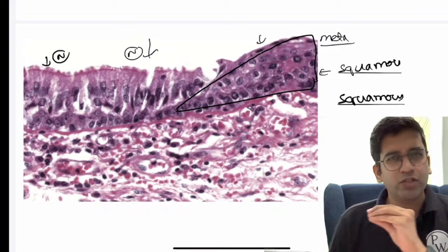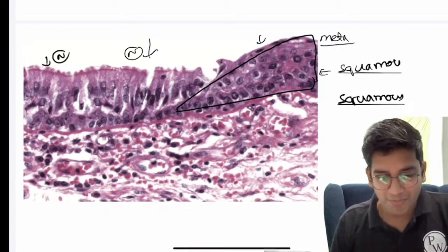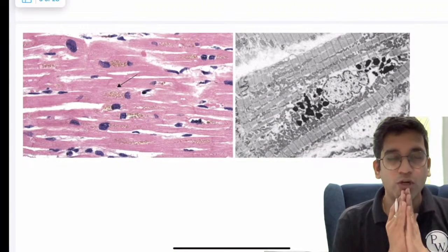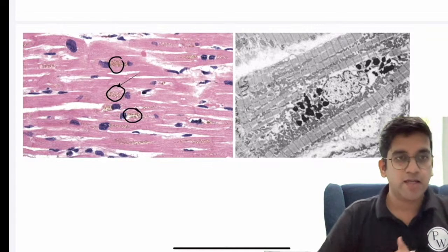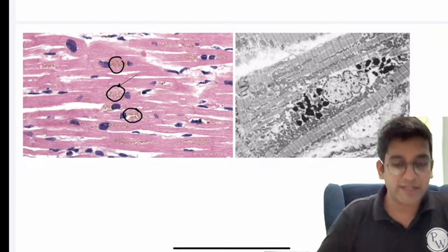We'll be going towards classical diagnostic images. We will not waste your valuable and precious time here. Next image, I want you to tell me what you are looking at. This is a cardiac biopsy of, let's say, a 70-year-old person. What are these? Hello, Rahul, good evening. Perfect, that's lipofuscin.